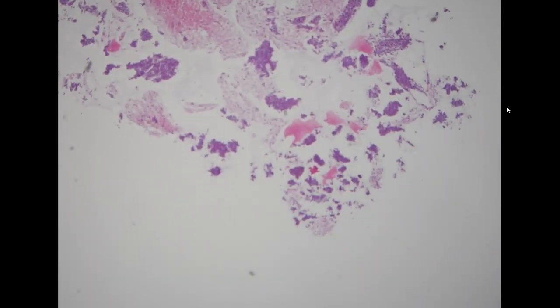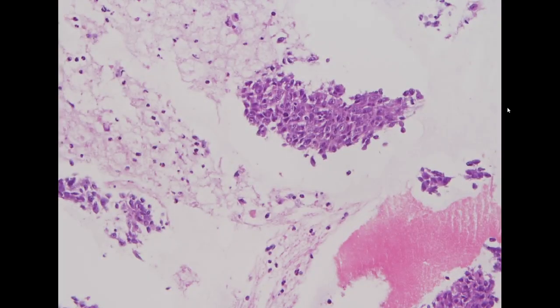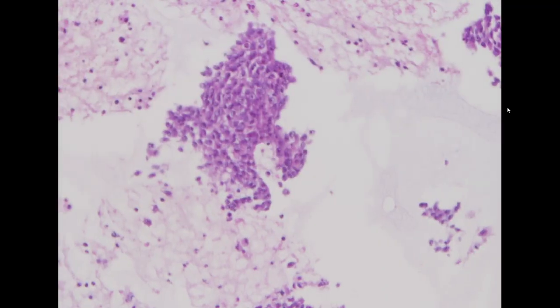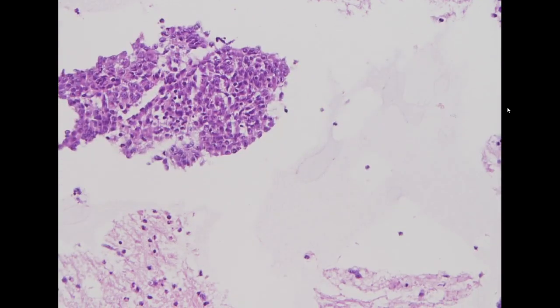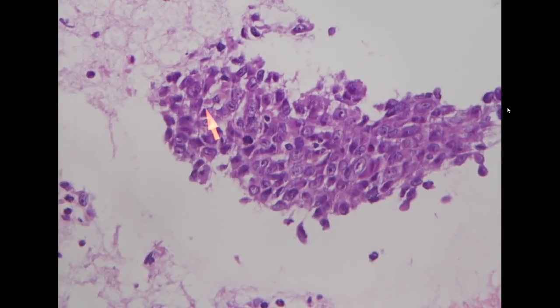So we did a cell block preparation, and we have a very tiny cluster of specimen. You can see, again, the cytomorphology is very similar. We only see solid sheets of these cellular fragments. The nuclear atypia is obvious, and it is very common that we can see some mitosis in these cell fragments. So it definitely looks malignant.